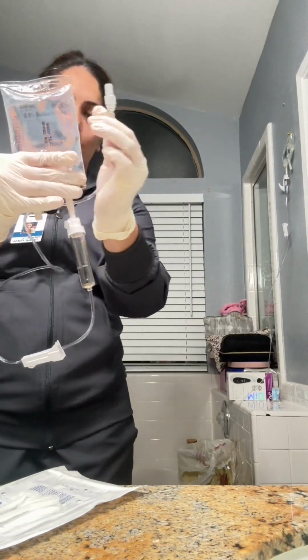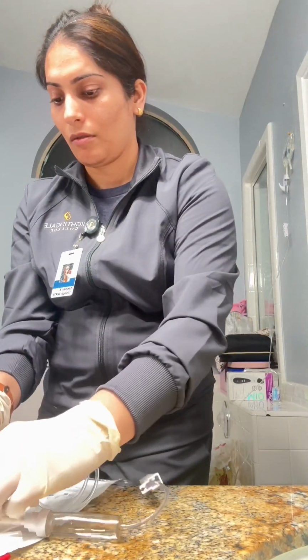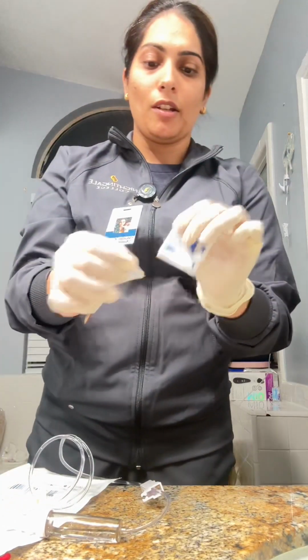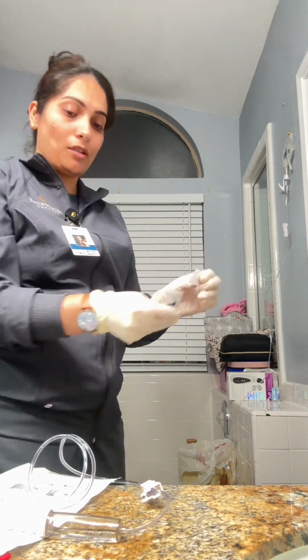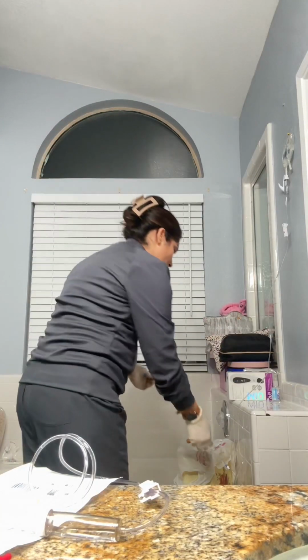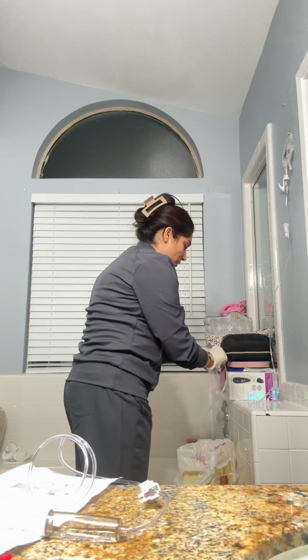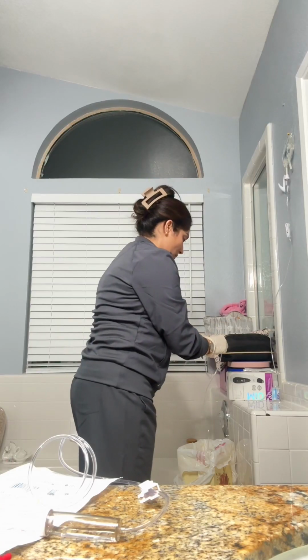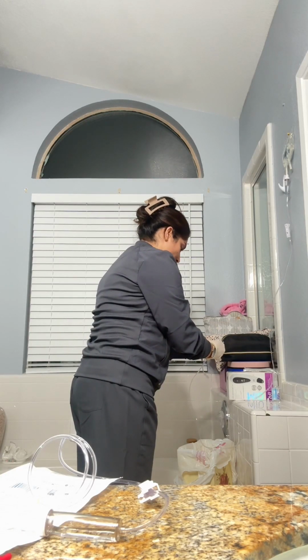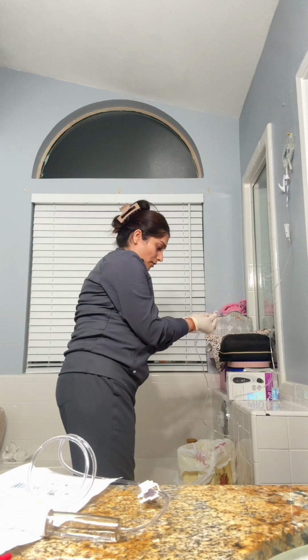Clamp this medication. We're going to take an alcohol swab and clean off our black port right here, and we are going to clamp it like this.